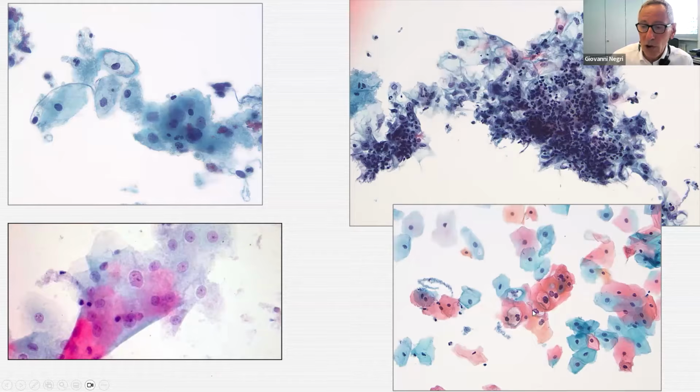In true abnormal cells, in true lesions, you usually see a dynamic in the smear. So you have some atypical cells, and then you have a background that is completely normal. In reactive changes and reactive conditions, you usually have quite diffuse changes without this dynamic that you have in dysplastic cells. In some cases, you may have quite large perinuclear halos, maybe because of degenerative changes, maybe because of accumulation of glycogen. But in that case, you do not have the atypia of the real koilocyte.